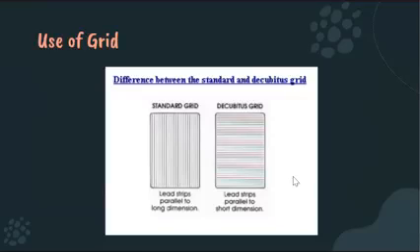A short dimension grid may be useful for examinations where it's difficult to correctly center the central ray for the long dimension grid. For example, for those patients who need to be in decubitus position. When we say decubitus position, the patient is positioned either supine, lying down, or lying on the side. When that happens, the central ray is horizontally pointed. It's the concept that counts. When the patient is lying down or on the side, the horizontal beam is pointed toward the patient.